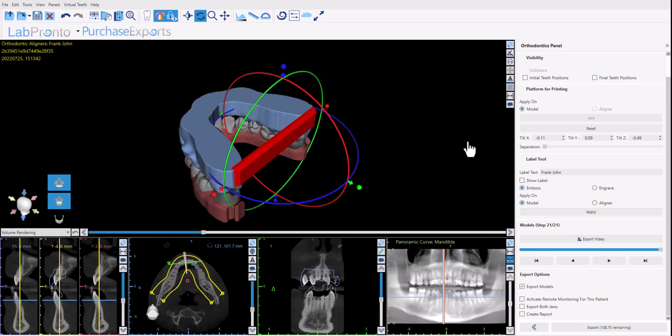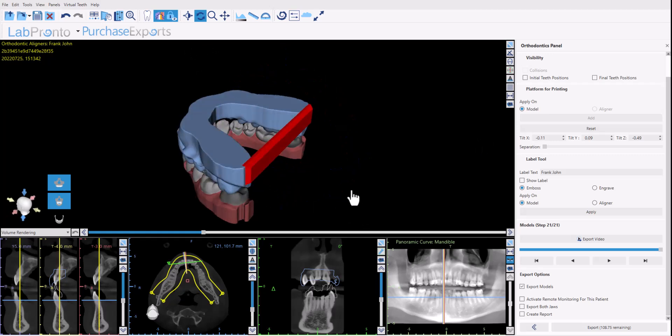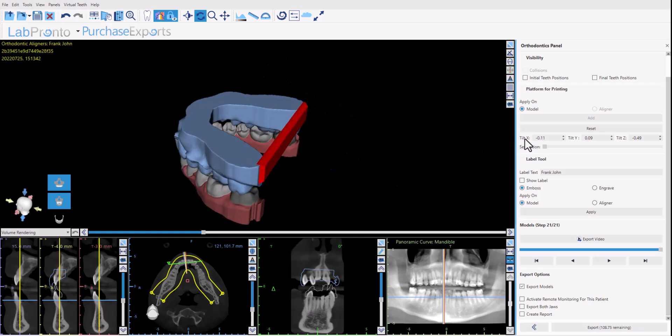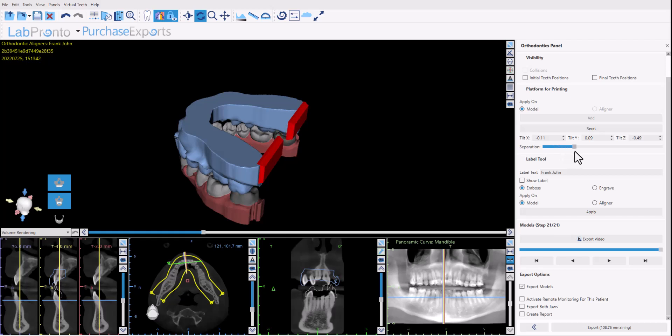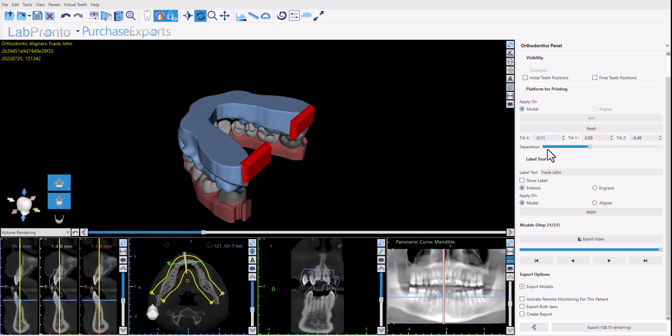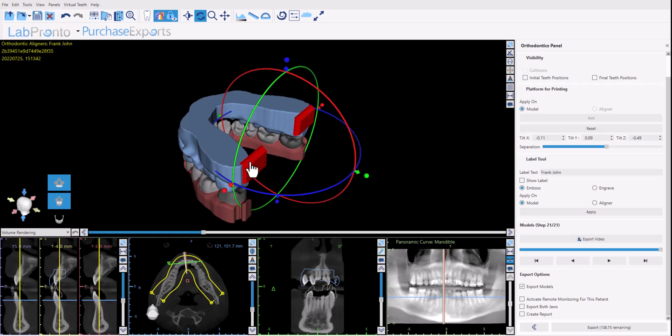You can also change the angle of the base using the values that we have here in the panel and you can use the separation slider to further reduce the amount of print time and material needed by separating the platform into just heels that cover the edges of the base.